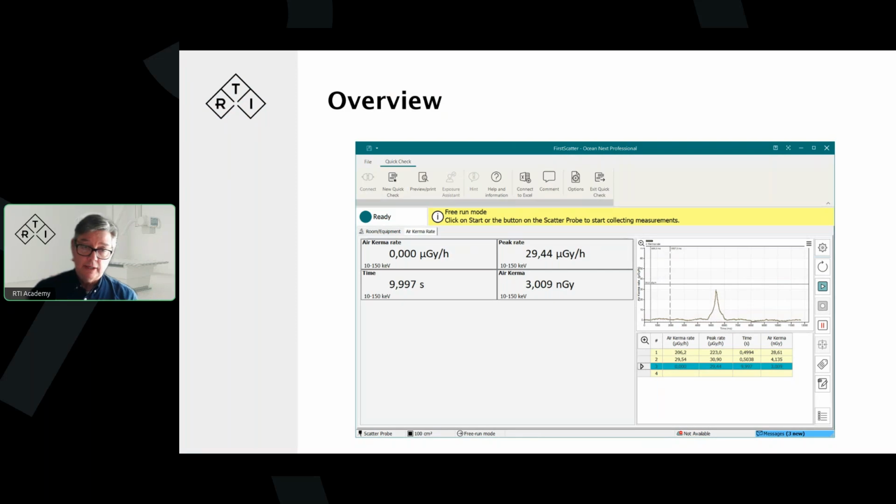So I would then, to make it realistic, it's always good to have a long exposure time, because then you can move around and maybe at least move a little bit for each exposure when you're checking the door, for instance, or some other. It is tricky to compare long exposure time, and especially when you're looking outside a lead-lined wall.